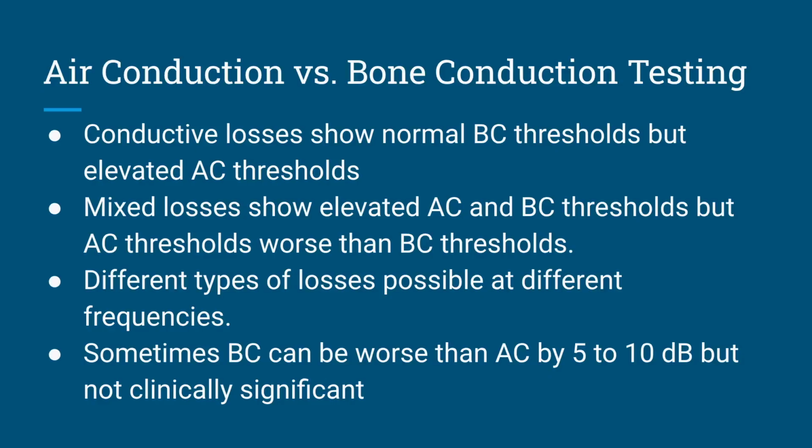Sometimes bone conduction can be worse than air conduction, but not usually by more than 5 to 10 dB. And it's not clinically significant. These negative air-bone gaps are not clinically significant. As I mentioned before, it can be from placement issues, it can be from malingering or feigning a hearing loss, but it can also just be from statistical variability, because air conduction and bone conduction thresholds are independent variables. You can, just by random chance alone, have an occasional bone conduction threshold that's worse than air conduction thresholds. And that's okay. Just document it how it comes out.